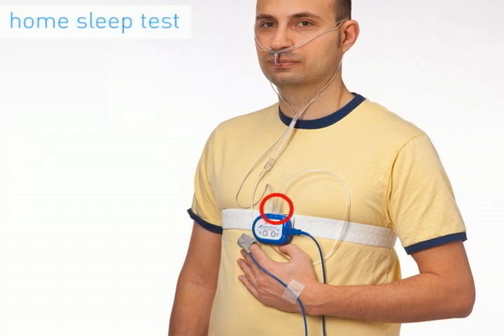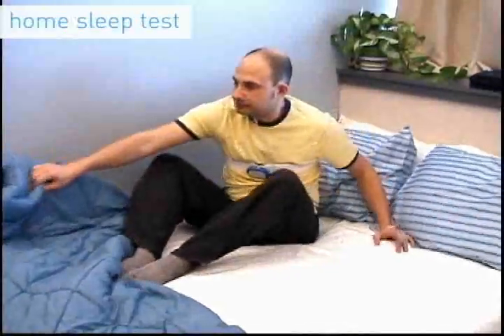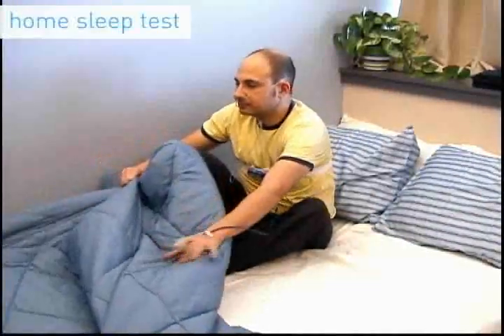The cannula connector is twisted into the SleepView. The patient's finger is placed in the Pulse Ox sensor. The SleepView is programmed by your physician to automatically start recording at the normal time you go to sleep, and turn off at the normal time you wake up. The entire hookup for the home sleep test takes a few minutes, and the patient sleeps in the privacy and comfort of his own bed.